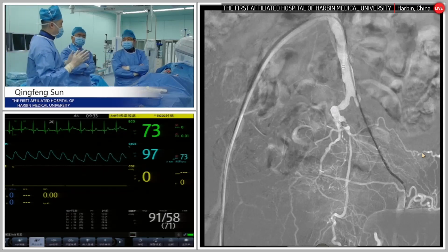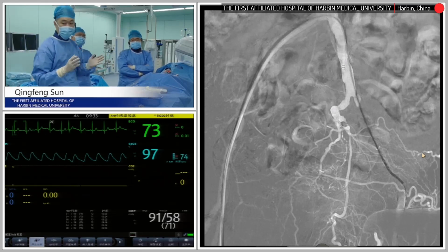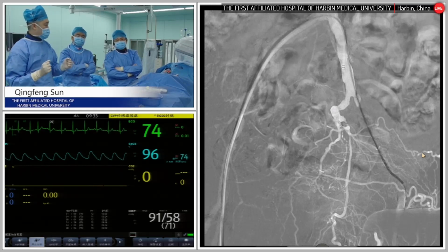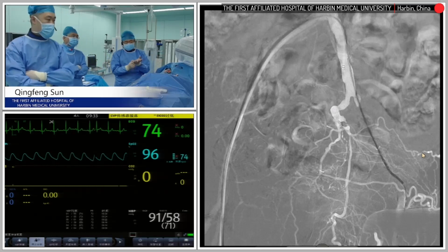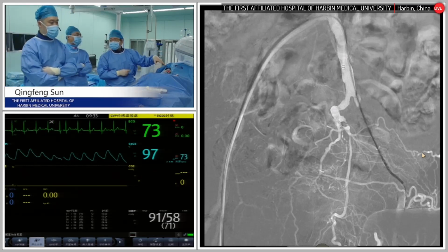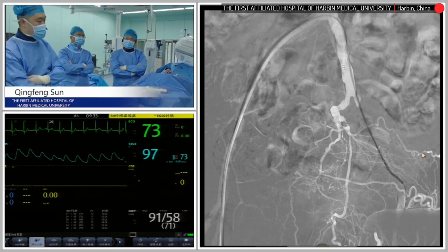Do we use debulking for the iliac artery before? Yes, I think the answer is yes, definitely. We used that before, but we are also taking a lot of risk, because of the rupture. Another option is CDT. CDT we can use, but this patient is 85.